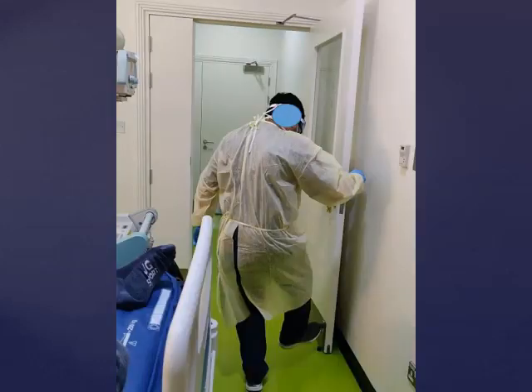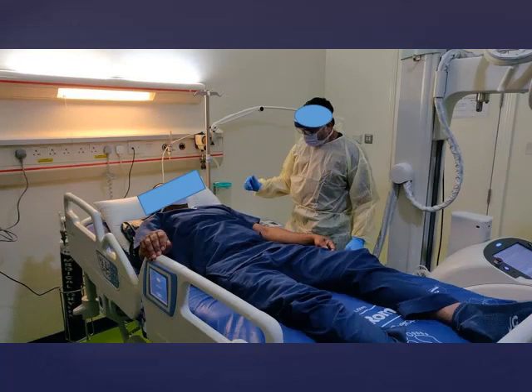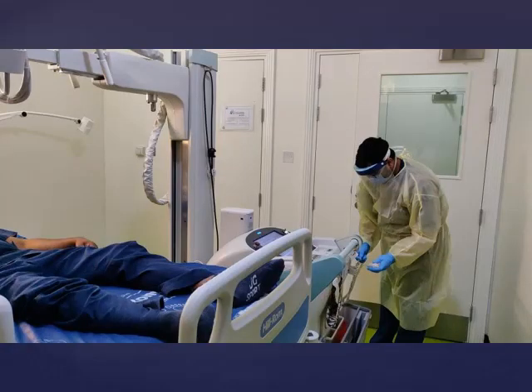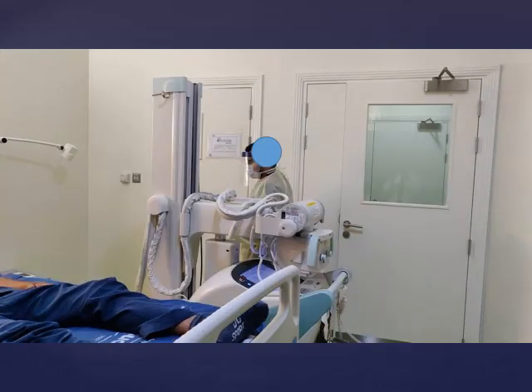Once you enter the patient's room, make sure all the doors are closed. Place the detector sleeve behind the patient. Ideally, ask the patient to sit up on their own to minimize contact. After placing the detector, give the patient instructions on what to expect during the examination. Sanitize your gloved hands since you have touched the covered detector, then do the centering. Sanitize your gloved hands again, take the exposure button, step into the anteroom, and expose. Once the exposure is complete, make sure the image acquired is adequate for diagnosis; otherwise, repeat the examination.